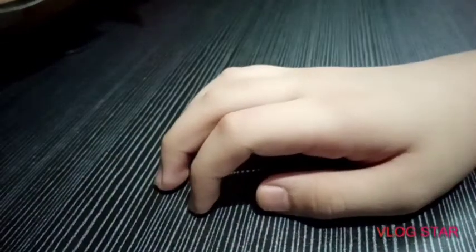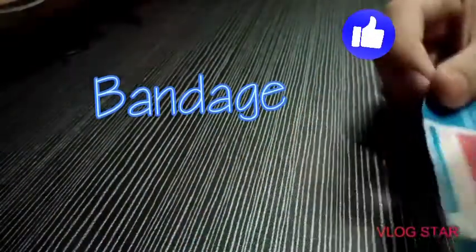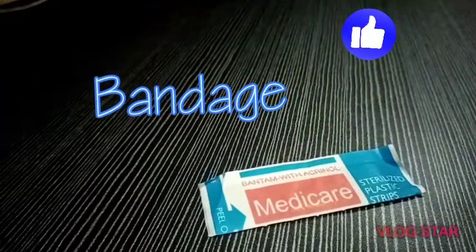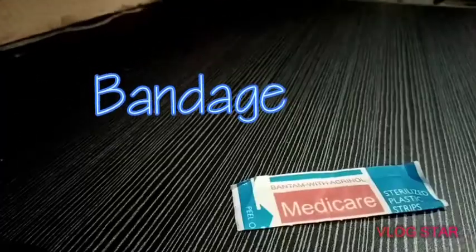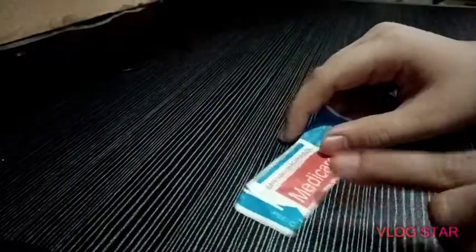Hello everybody, and today I will teach you how to use a band-aid like this one properly. This stuff is called a band-aid, and I guess you know it, so I'll teach you how to use it properly.